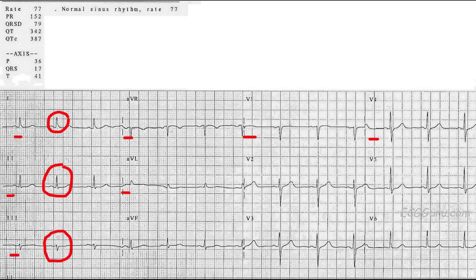It's really great when you realize that some leads show things better than other leads. Lead three doesn't show P waves very well. So if I had any concerns about whether or not there were P waves, I would just look straight up and see that there are P waves in lead two — so the patient has P waves. That's not a concern.